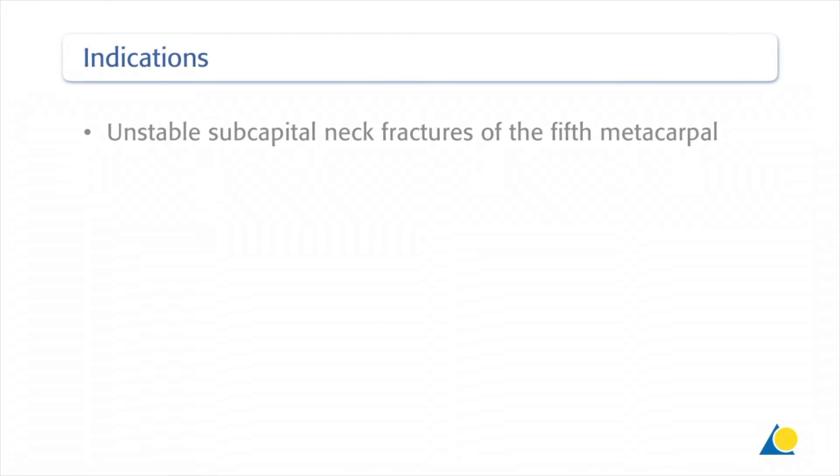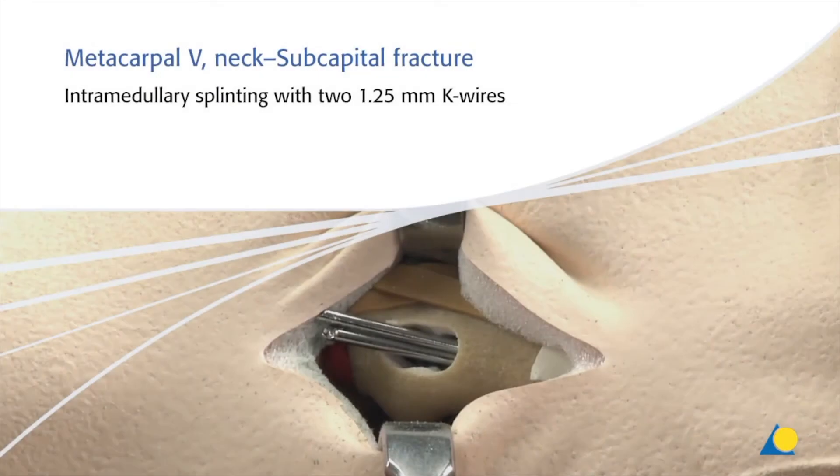This procedure is indicated for unstable subcapital neck fractures of the 5th metacarpal. In the first exercise, a subcapital fracture of the 5th metacarpal will be stabilised using two 1.25 mm K-wires inserted into the medullary canal.